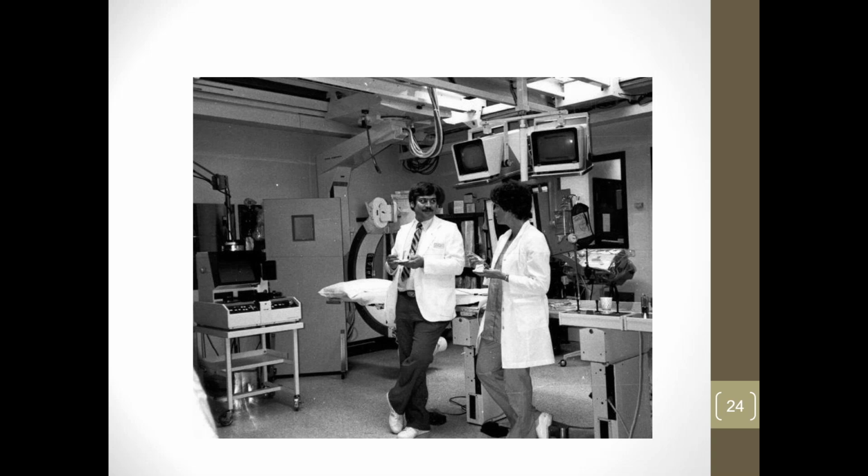So the patient's up here, they're doing the procedure, and he has to go, hey, I need to find out where that obstruction was or where that narrowing was. So he would sit down here, the technician would spool the film up on the one side, run it through the reader, and then spool it up on the other side. And then the cardiologist had a set of foot pedals that he would step on to advance it or bring it back depending on what he wanted to look at.